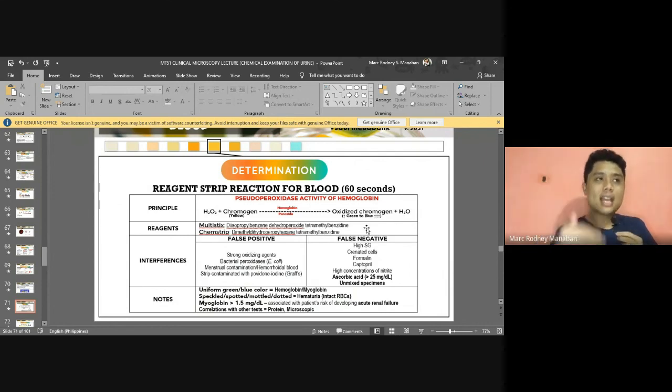So same siya sa second part sa glucose, di ba? Oxidase na method. So inanagyapon siya. Basta mga peroxidase. In this case, your hemoglobin or myoglobin serves as the peroxidase, no? So muna siyang pseudoperoxidase. So pseudo, di ba? Pseudo false or peroxidase-like. So kaning hemoglobin or myoglobin na siya capability to assume a peroxidase na function. Okay? Alright. Now reagents, at sa itong reagents, tetramethylbenzidine.